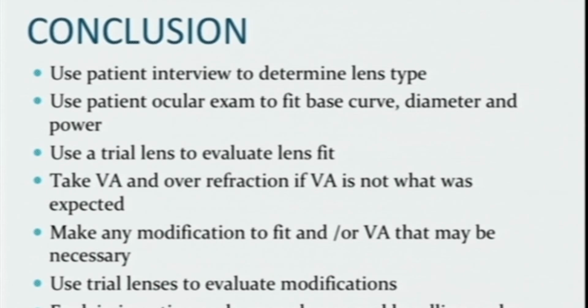Explain the insertion, removal, care and handling and cleaning to the patient. Because if it is being delegated to somebody else in the front office, we have seen patients using the lenses for 6 months without removing the lens throughout. And then they come back with a severe corneal edema, and then they'll have to use just glasses in spite of the treatment given, and the visual acuity also suffers because of that.